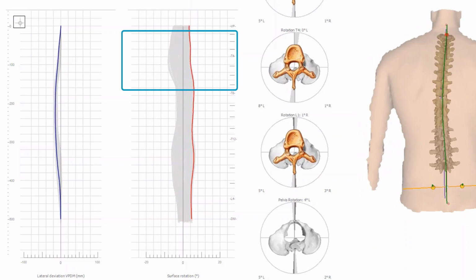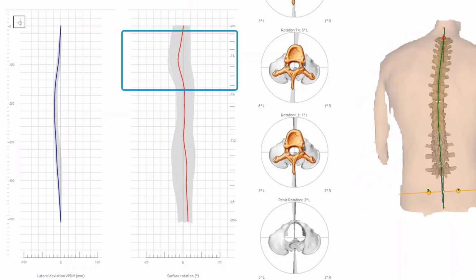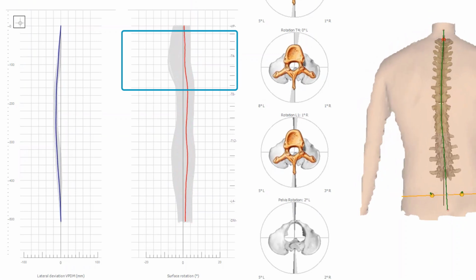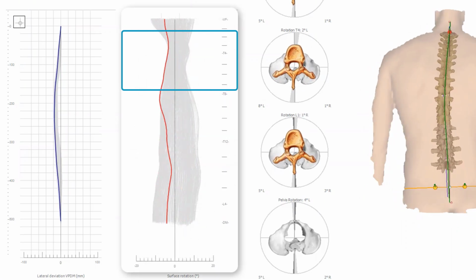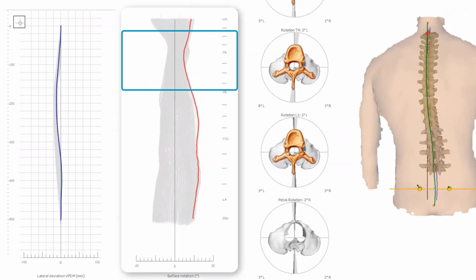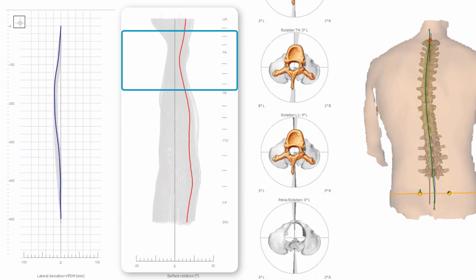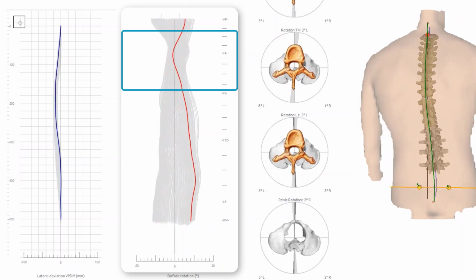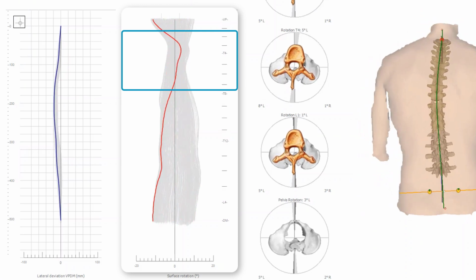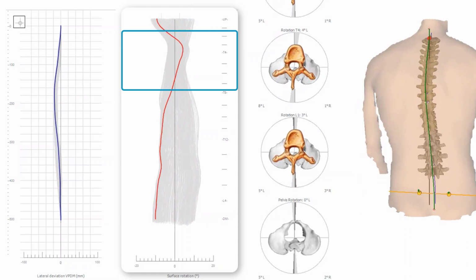The harmony in which this movement takes place is an important subjective assessment criterion for classifying functional abnormalities. If the rhythm is disturbed, this can indicate a local blockage or coordinative disturbances that unnecessarily move the body's center of gravity out of its central position. This approach extends to the interpretation of individual, very local outliers that are triggered, for example, by segmental structural disorder.